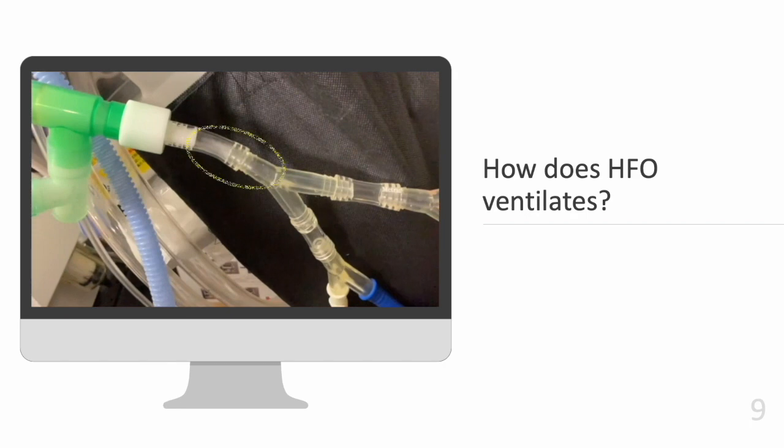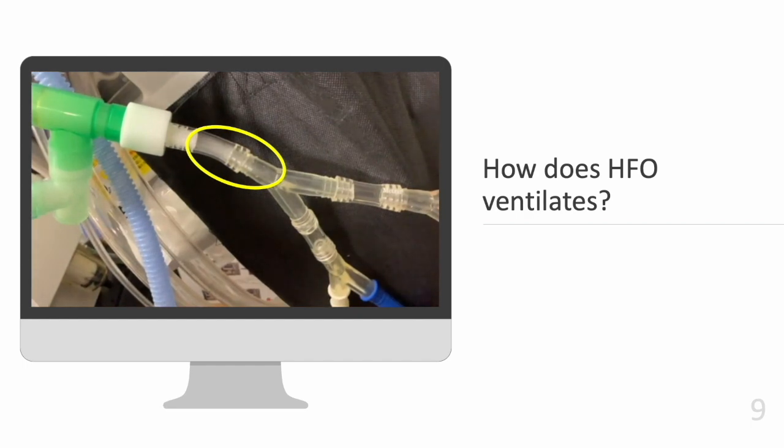This video shows the actual ventilation with HFO by filling the ventilator circuit with smoke. The smoke can be observed returning to the ventilator side while moving back and forth due to the change in pressure caused by HFO. Even with a small amount of tidal volume, we could observe by the smoke movement that ventilation is possible by using high-frequency movement. But it is still a matter of wonder why artificial ventilation is possible with this method.